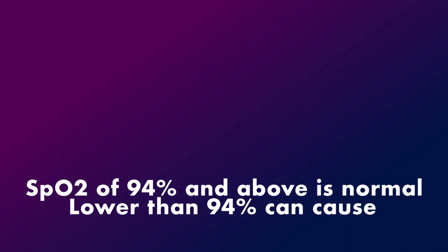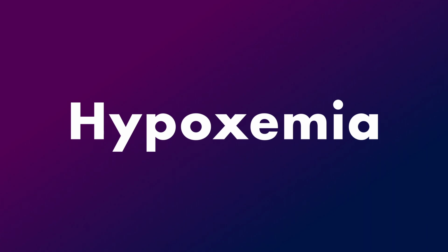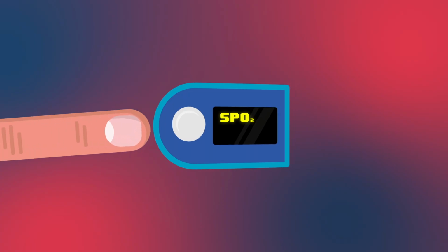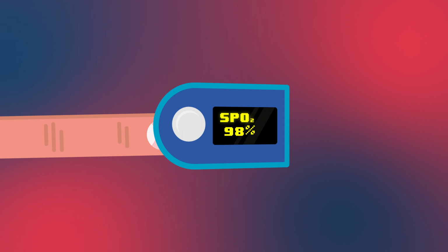Knowing how much oxygen is in your blood is vital to your health. The oxygen level can tell you about various lung diseases. For detecting the amount of oxygen in your blood, we use a small device called a pulse oximeter that attaches to your finger and shows the amount of oxygen in your blood. The device uses a technique that is similar to how blood color works.